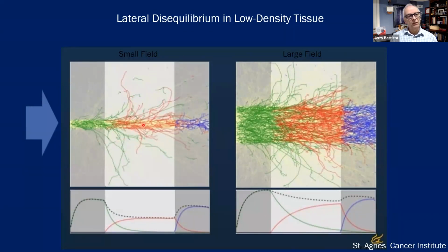These red ones are generated in the lung, and the purple ones are generated at the back end in water again. If you expand the field size, then you can start to see some equilibrium here if you use your imagination, because there are electrons that fly out, but because there's enough electrons coming from the outside region, the lateral region, it builds up again, and we have a reasonable dose.